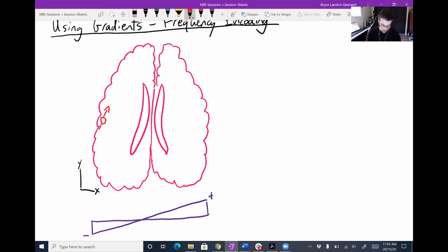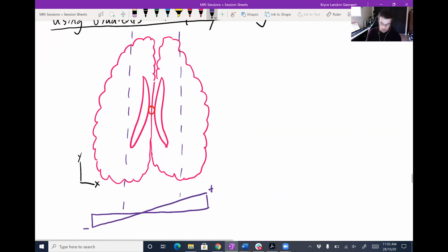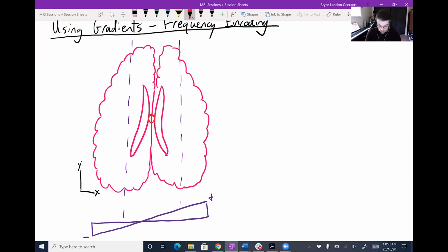I think I remember why I did this separately. I lost part of my brain. Just going to draw some bands over here. We're only going to do 3. Not really necessary to do more. I'm going to draw the protons themselves separately, just in a little 3x3 grid over here.